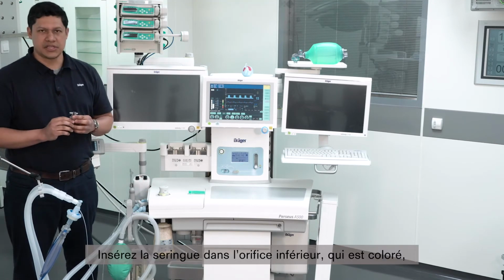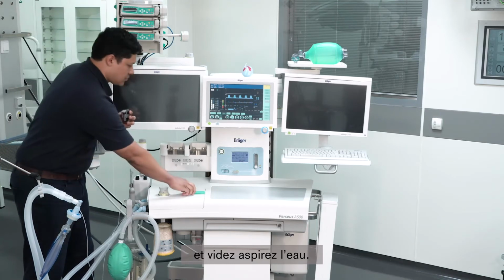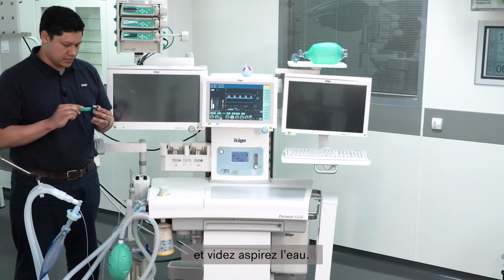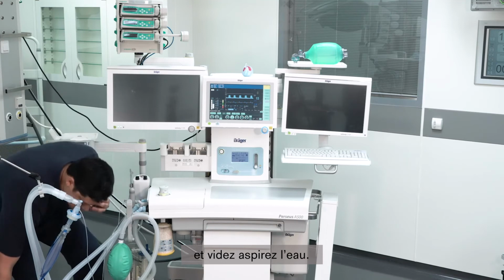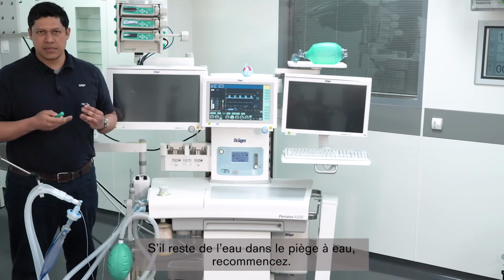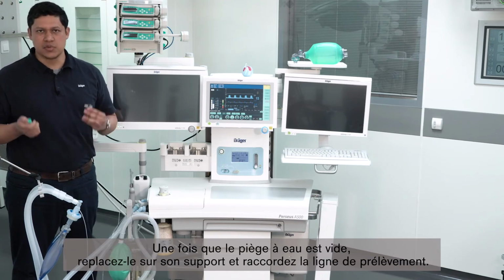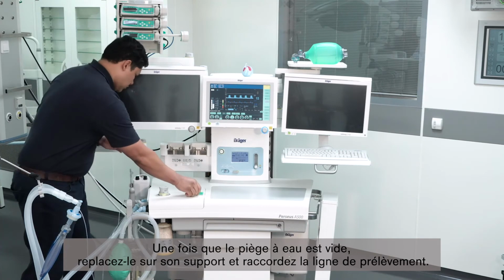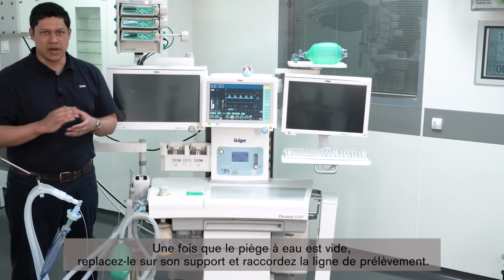You will place the syringe in the lower port, the one colored, and you drain it. In the case there is more water in the trap, you might have to repeat the procedure. Once the trap is empty, you put it back on the port. And you place back the sample line.